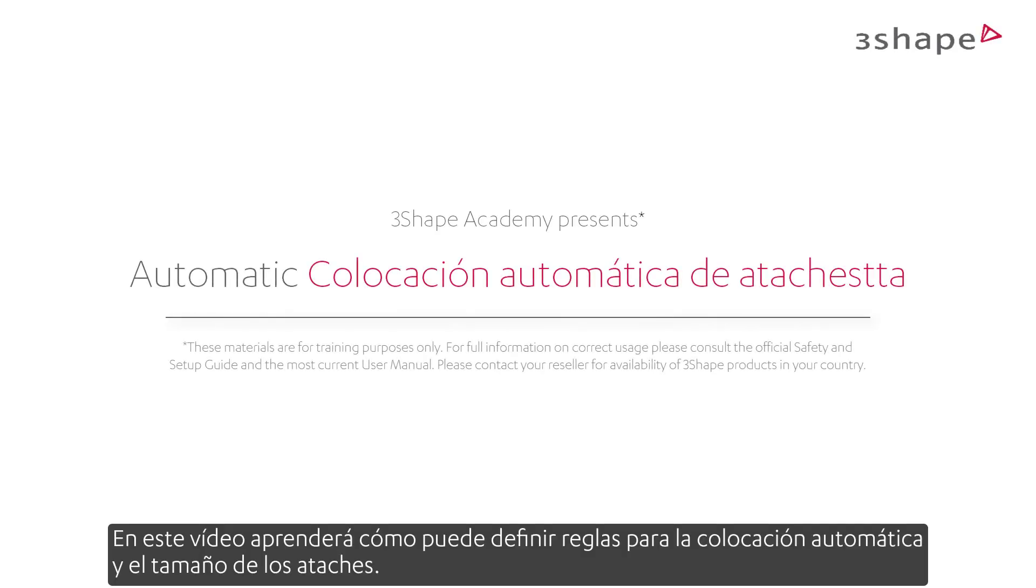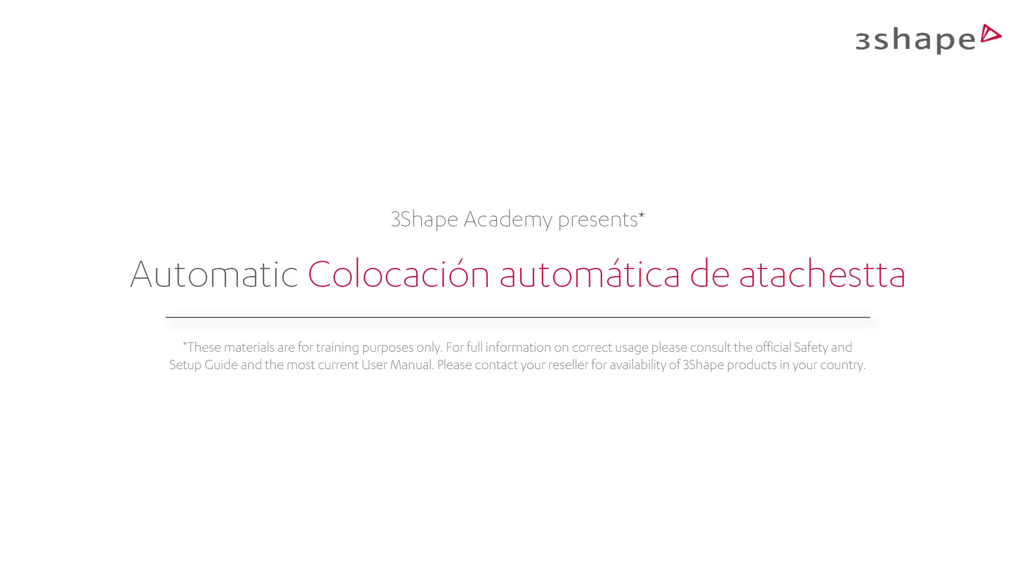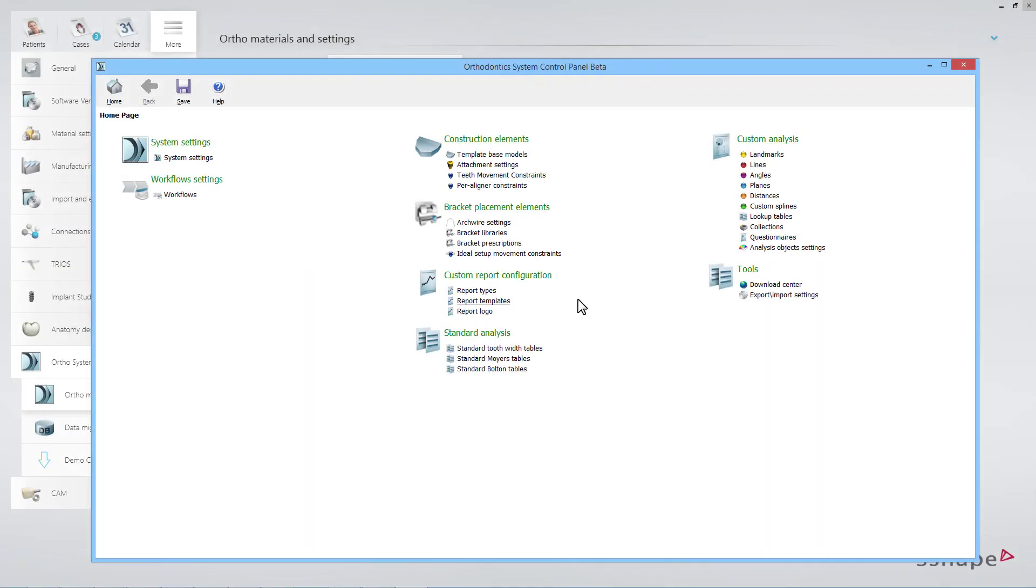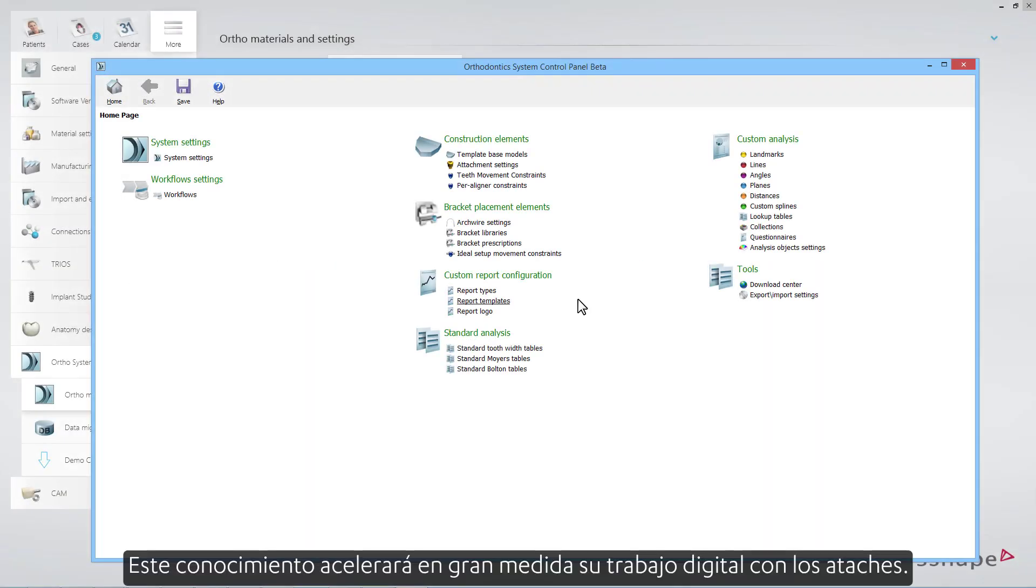In this video you will learn how you can define rules for automatic attachment placement and sizing. You will also see how to apply them inside the software. This knowledge will greatly speed up your digital work with attachments.